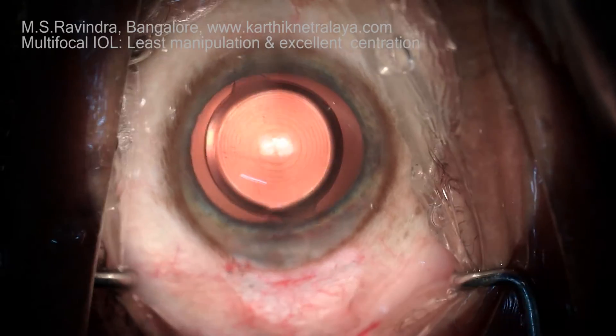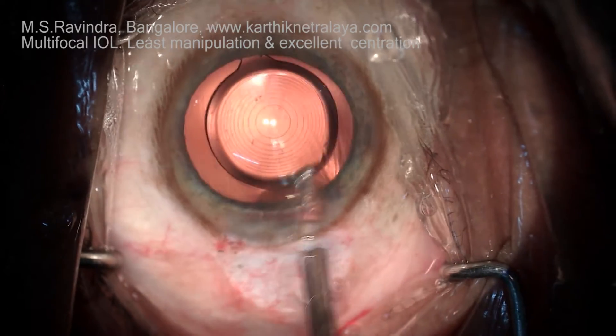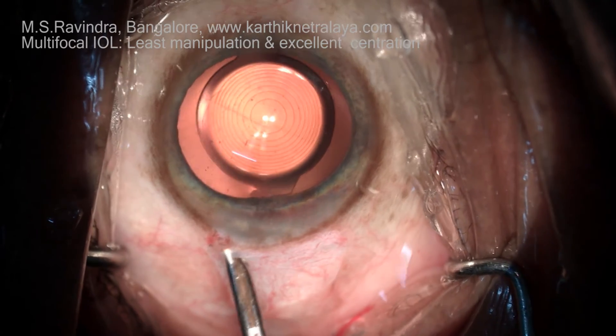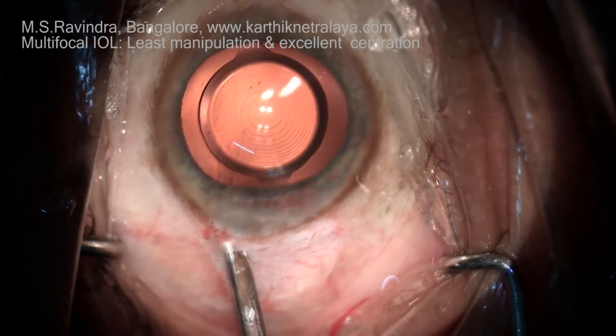Now it's rotated back slightly. One of the haptics can be rotated so that the lens is positioned correctly, and the patient is asked to look at the light of the microscope — specifically the middle of the two lights — so that the visual axis is aligned.